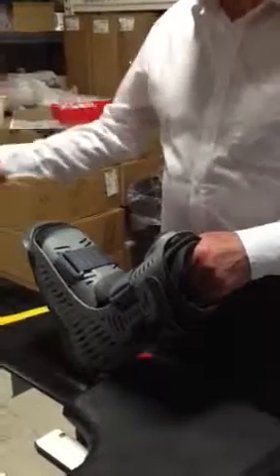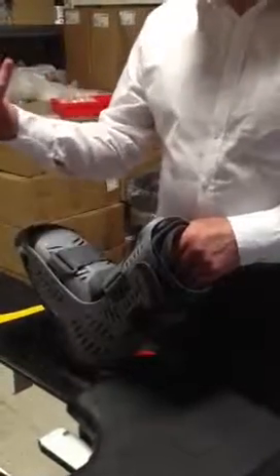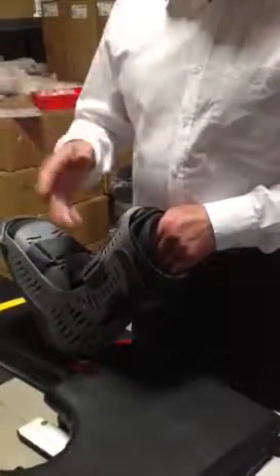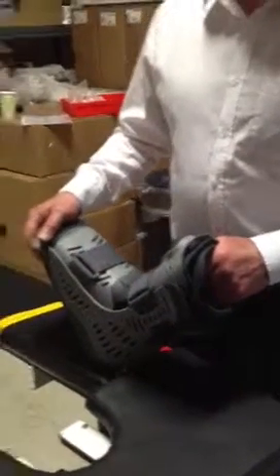And you sell, you know, the capital equipment is the pump, and what it's doing is it's basically inflating and deflating all the time. And we put that on both legs, and it starts the minute the patient is induced, and it stays on until they're mobilised out of bed, and it just helps reduce incidence of DVT.